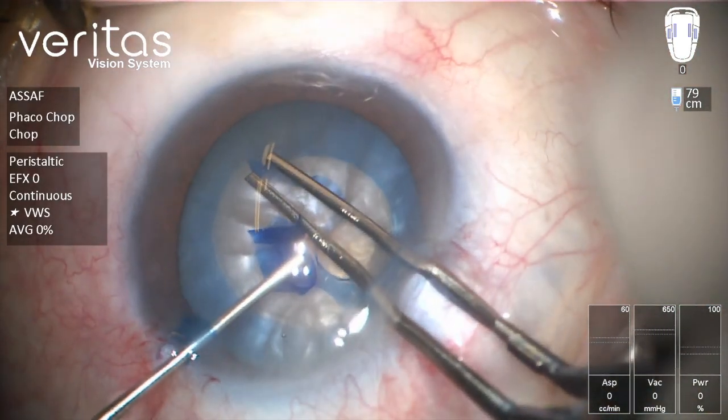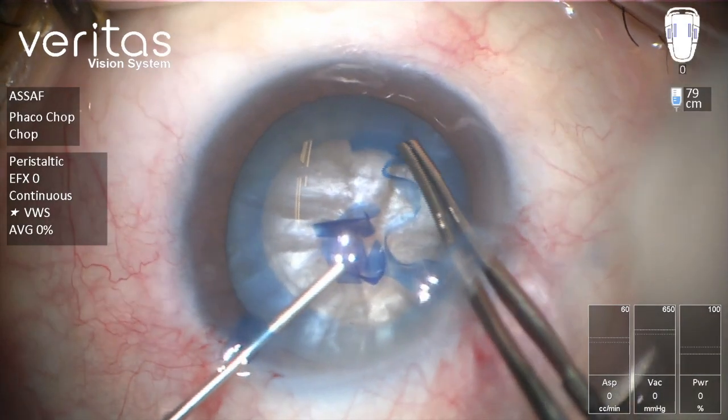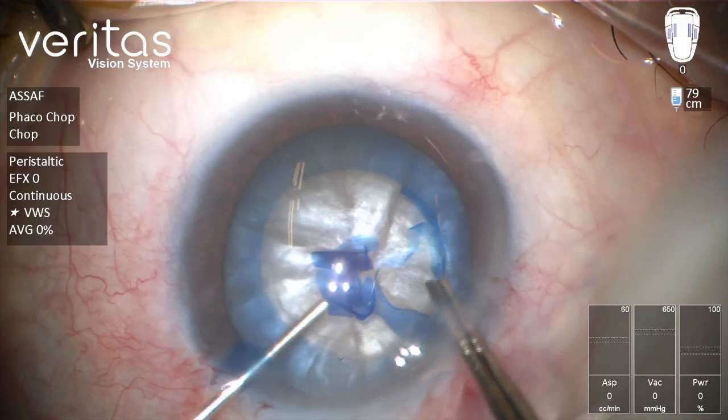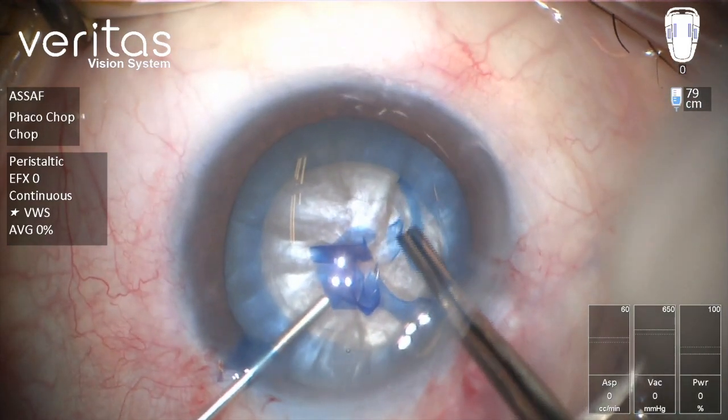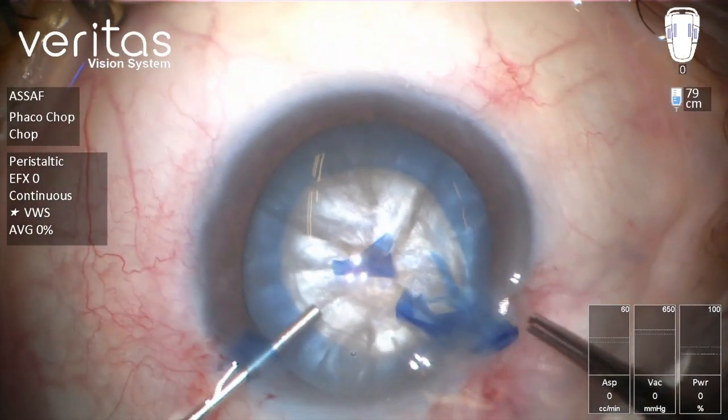And then we can move forward to continue flap creation. Now this is a reasonably good-sized rhexis.